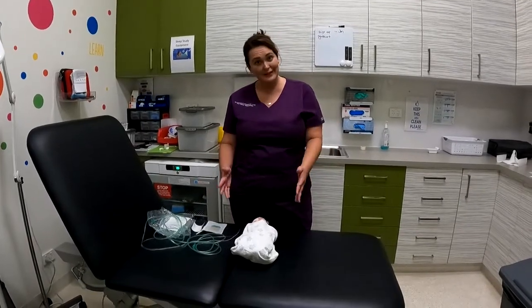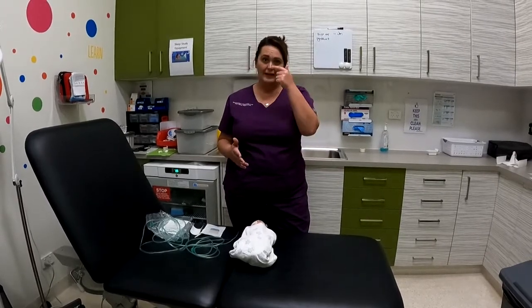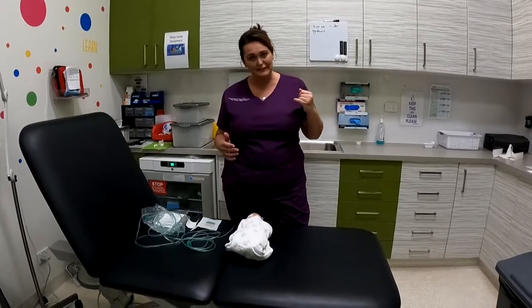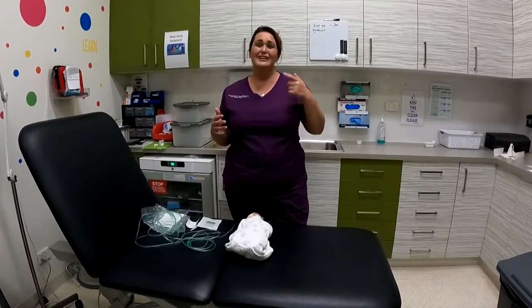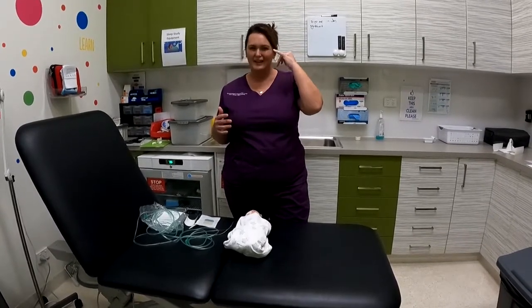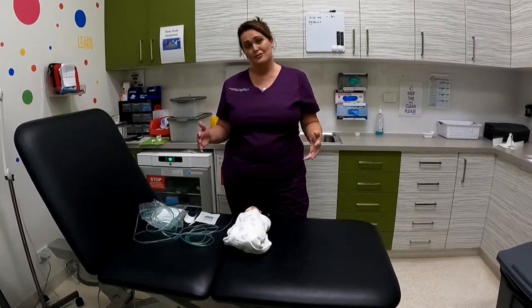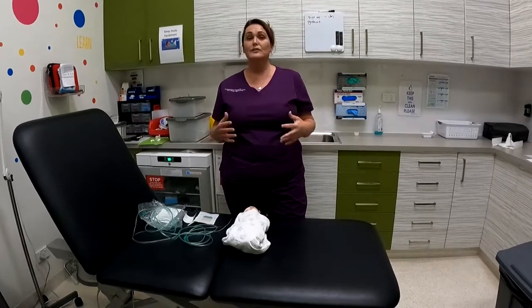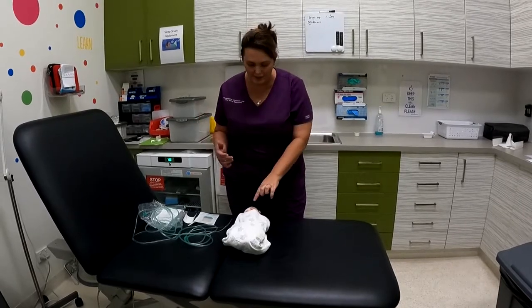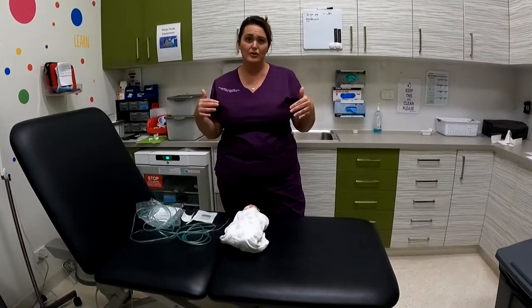So now to looking after your baby on oxygen. Oxygen can sometimes be a little drying to their nose, and so it can make them a little bit sniffly. Often babies on oxygen can have a little bit of a sniff because, as I said, the oxygen dries their nose out and it can cause a bit of extra secretions there. One way to counteract this is with normal saline. So you would have seen the nursing staff in the hospital use normal saline drops in your baby's nose. And this is just to keep their nose from drying out.